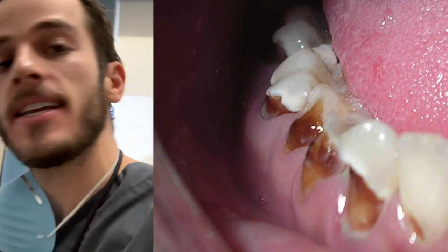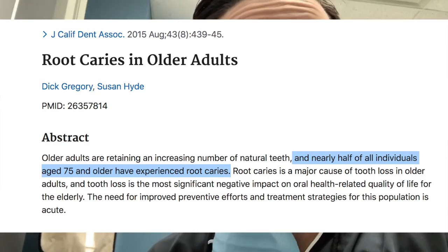Okay, so this patient, we just did two gum line cavities. So top left, bottom right. These are super common in older patients. You see these cavities that exist right along the gum line. They're also known as class 5 lesions. And so I just did two of those. Pretty easy to treat, very common in older individuals.